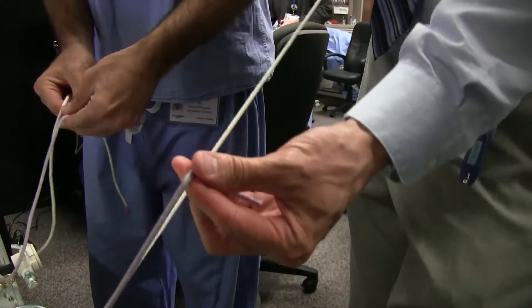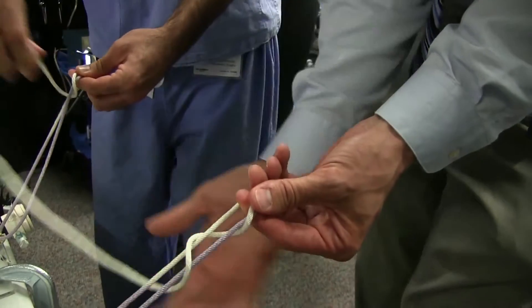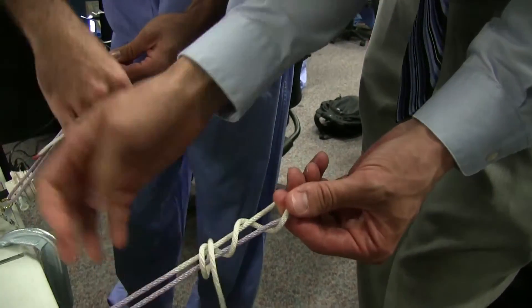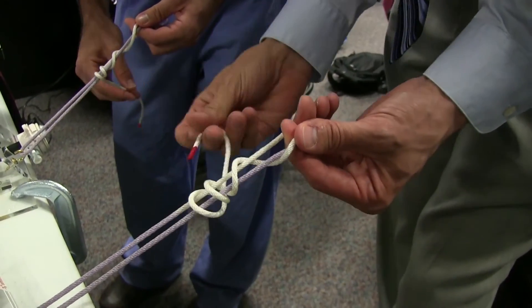We're going to start here, we'll go around the post hand like that. Like this? Yep. And just go around here three times or so, two or three times. Snashes just like that. And then you go back through that little triangle right there.